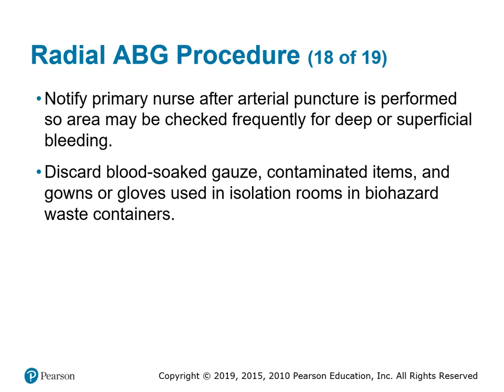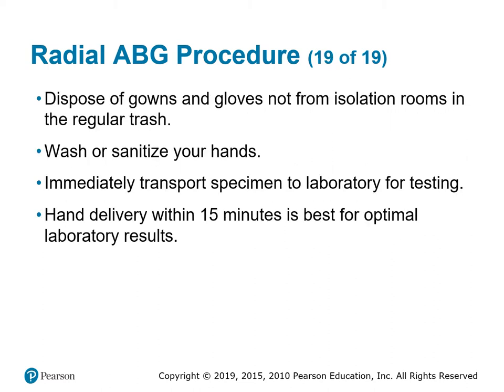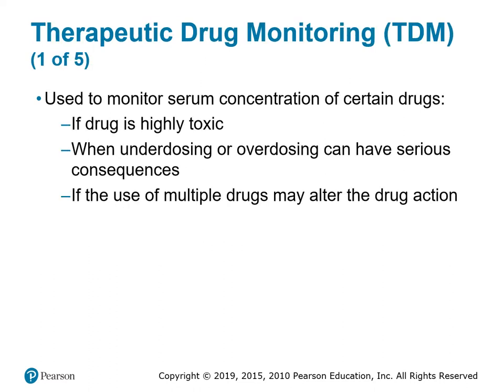Notify the primary nurse after the arterial puncture is performed, so the area may be checked frequently for deep or superficial bleeding. Discard blood-soaked gauze, contaminated items, and gowns or gloves used in isolation rooms in biohazard waste containers. Dispose of gowns and gloves not from an isolation room in the regular trash. Wash or sanitize your hands. Immediately transport specimens to the laboratory for testing. Hand deliver within 15 minutes for best optimal laboratory results.